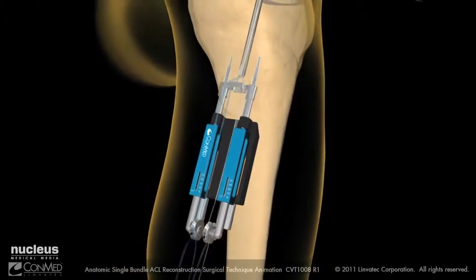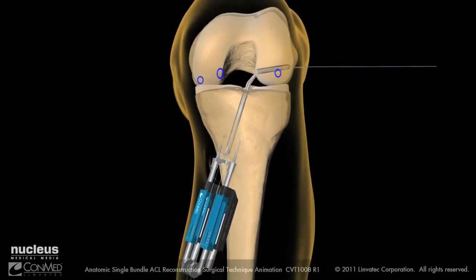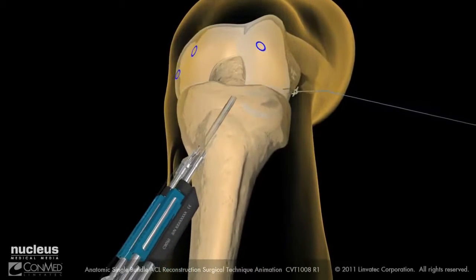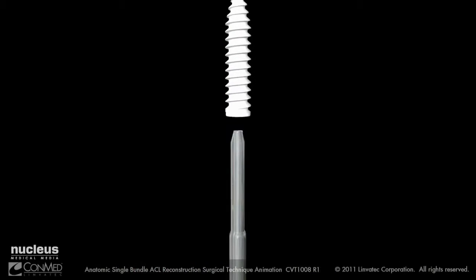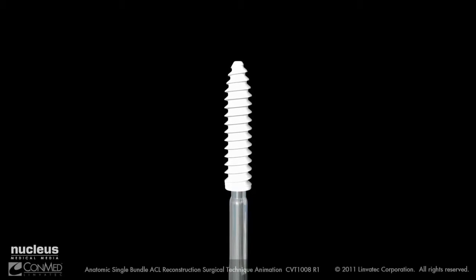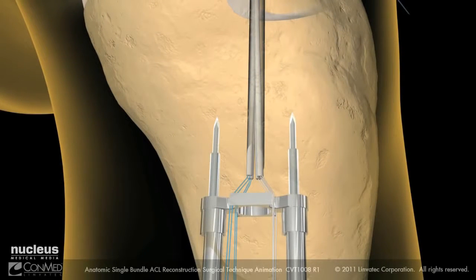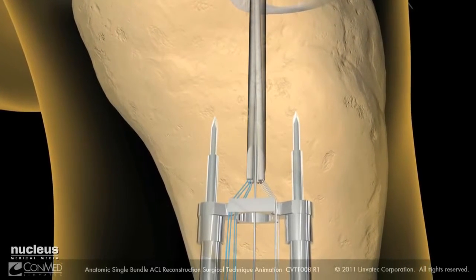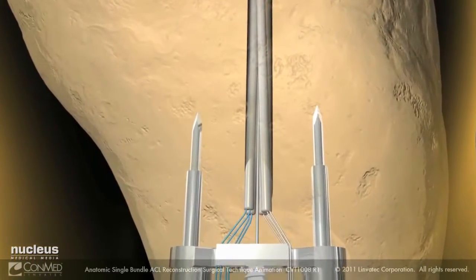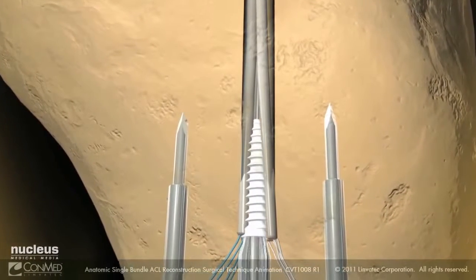Apply the desired graft tension and then cycle the knee to alleviate laxity. Hold the knee at 15 degrees of flexion and set the desired final tension. Load the appropriately sized Genesis matrix onto the tri-lobe driver. Ensure that the knee is in 15 degrees of flexion. Advance the Linvotec BioScrew Hyperflex Guidewire into the tibial tunnel and in the center of the four graft bundles. Load the matrix screw and driver onto the guidewire and advance it through the tensioner and into the tibial tunnel until it is flush with the external tibial cortex.